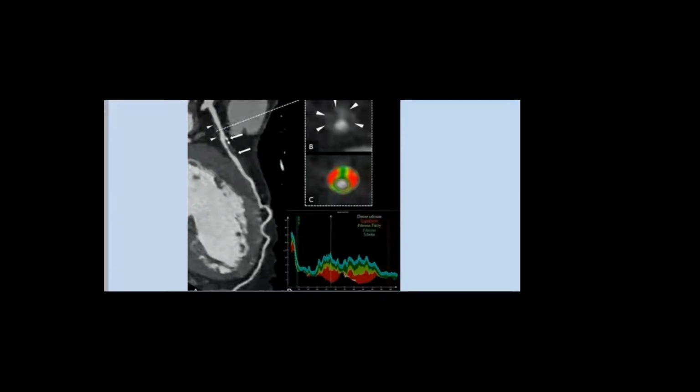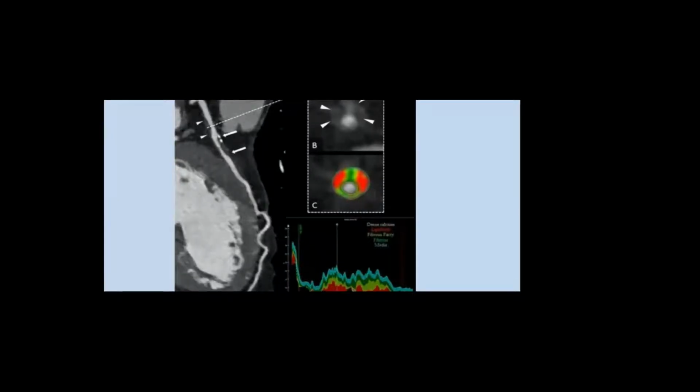The arrow points to what? If I zoom in, look here, I'm zooming in. You start to see what? Atheroma, you know, this soft or non-calcified atheroma with spotty calcification. Let me show it to you now, just a moment. You see this part here? You see, there is soft, beside the contrast, there is a low attenuation part. This is atheroma. Again, here is atheroma.